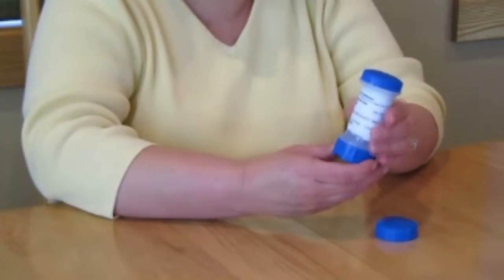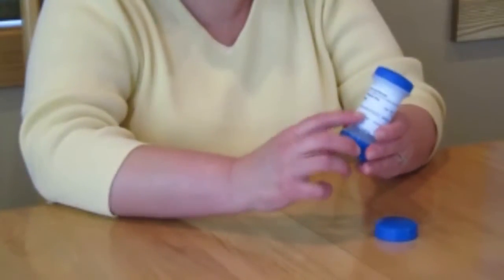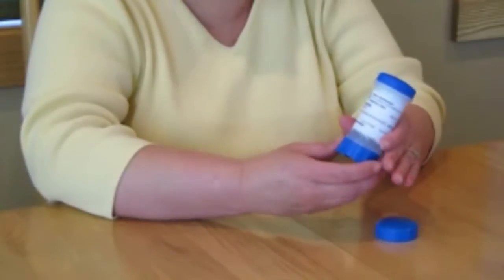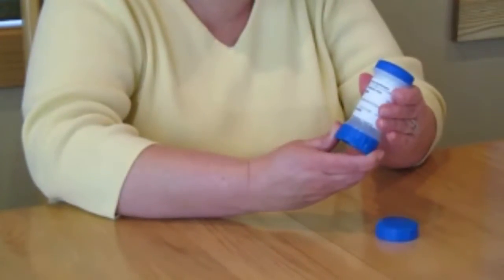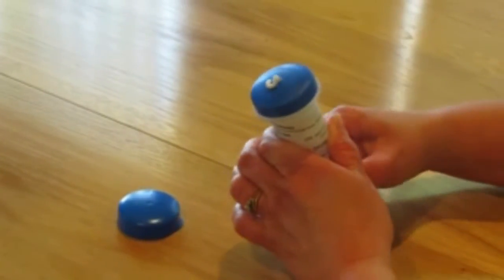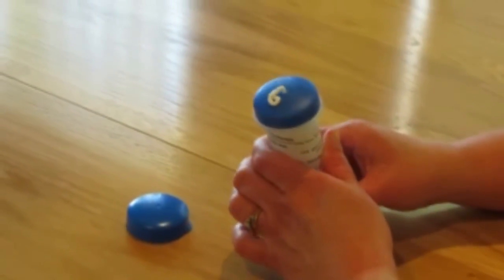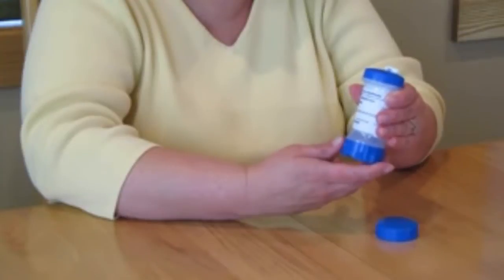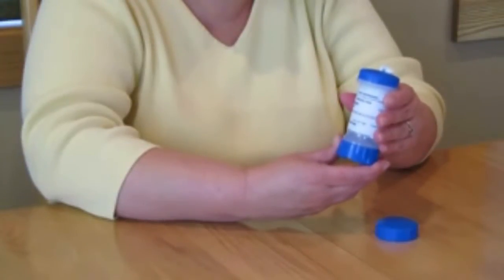Turn the base of the dispenser the number of clicks that is specified on your label. The base will solidly click or lodge into place. You will feel it and hear it do so. Leave it in this position after every click. Do not try to use partial clicks.